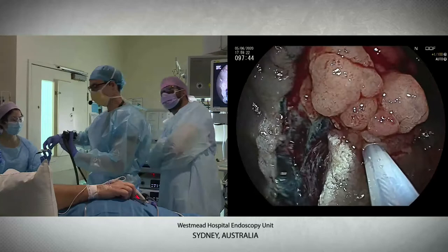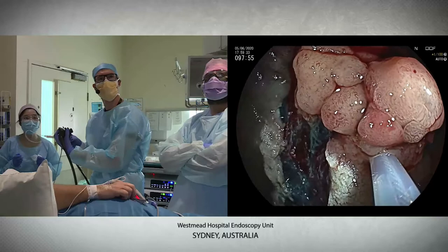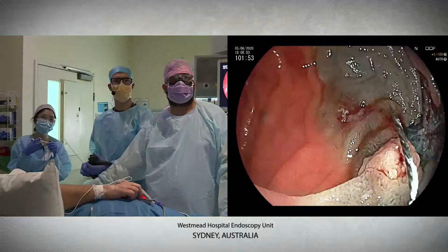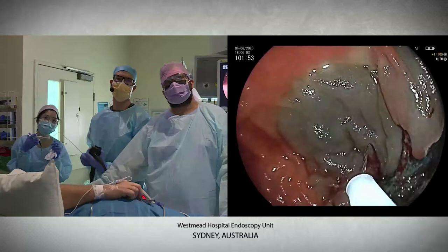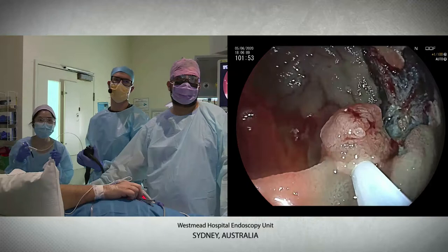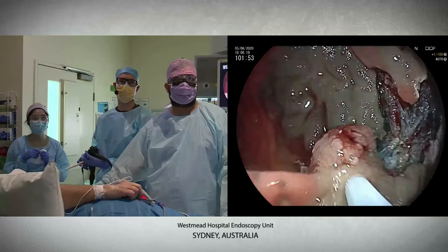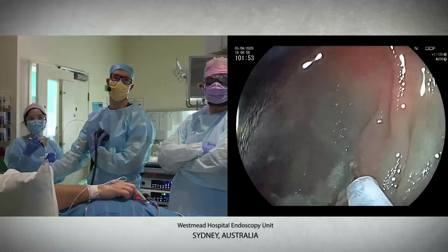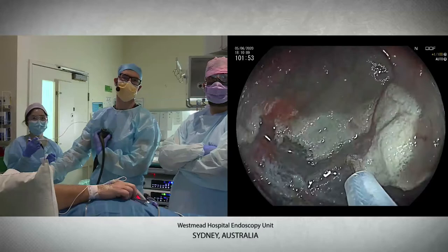Good. Okay. Close. Pull back slightly. Look a little bit and point back. Push in a bit. Push in a little bit. Hold there. Open. Rotate. Oh yeah, it's nice photos. Hold there. Open things.